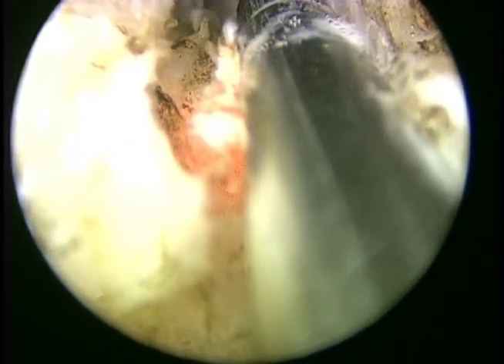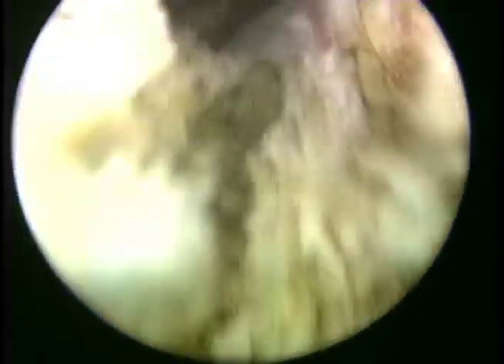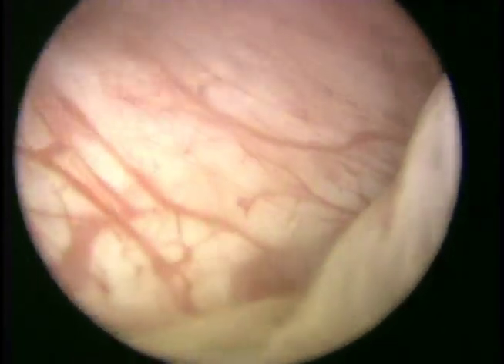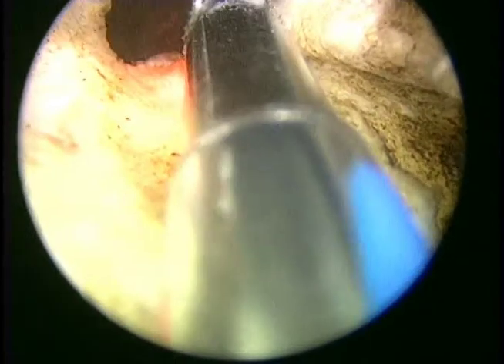So the motions are always from bladder neck back to verum montanum in a slow sweeping manner, increasing the power as the tissue becomes more dense and deeper into the prostate we go. We generally increase from 80 to 120 watts once we've created a large working space, and we keep that energy setting until we really develop the two edges of the tissue we want to remove, be it the floor, the left lateral lobe, or the right lateral lobe, and only then will we bring it up to 180 watts to really vaporize that pedunculated piece of adenoma.